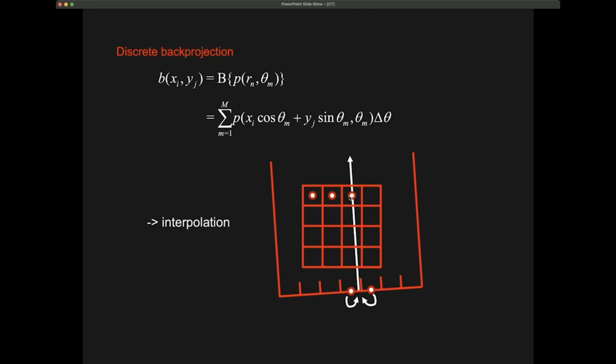So if we want to measure, or calculate, or redistribute values on this line, what we need to do is interpolate between two pixels that we actually measured. So these are the individual crystals on the detector, where we did the measurements, and we need to smear that out. Now, interpolation, and especially interpolation under different angles, is in a way tricky. It's something that we ideally would try to avoid as much as possible. Sometimes it's unavoidable, but it's computationally costly, and also you need to put in an interpolation function, which you don't really know.